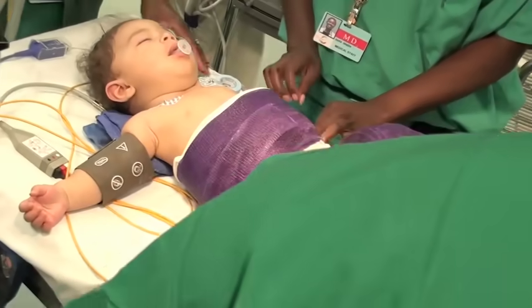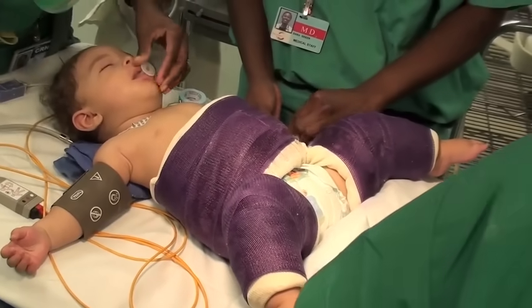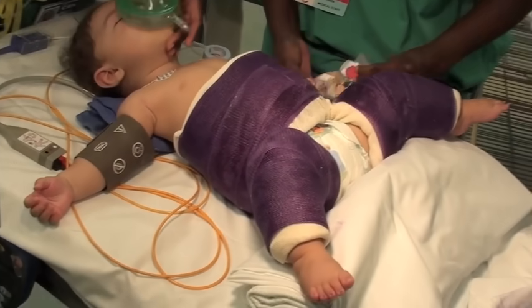This is the finished cast, which is trimmed, and has room for the baby to go to the bathroom or to put a diaper in place.